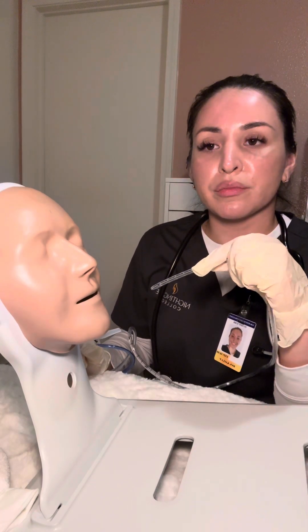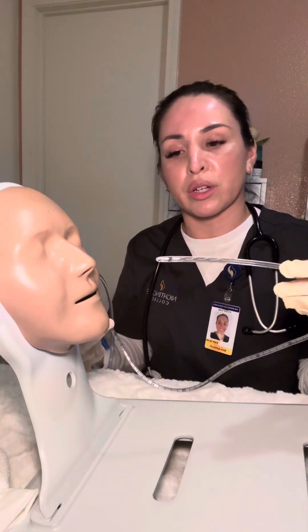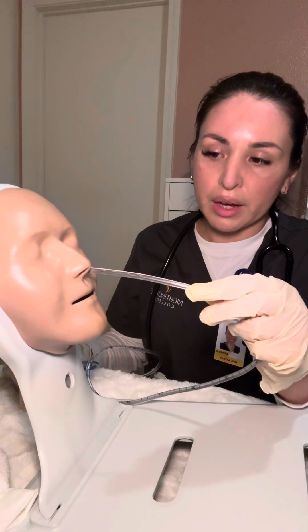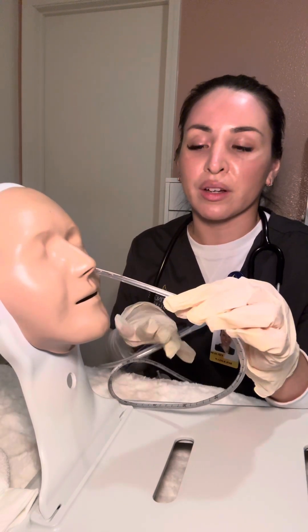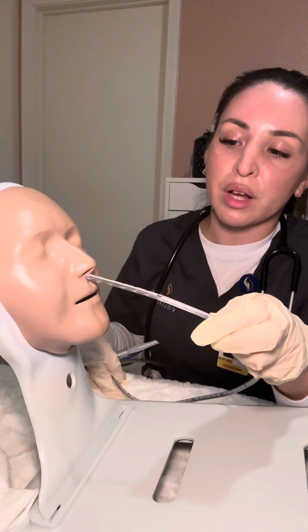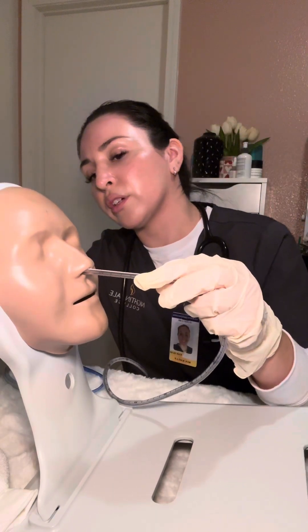I want to make sure the tube is going naturally in the form we want it to go. We first insert it and direct it towards the floor of the nostril. If we feel any sort of resistance and the patient is uncomfortable, we're going to take it out, lubricate it again, and then try the other nostril — same approach, directing it towards the floor of the nostril.